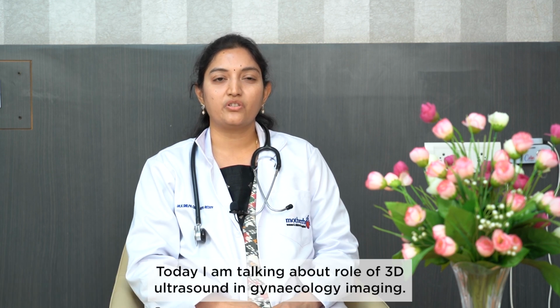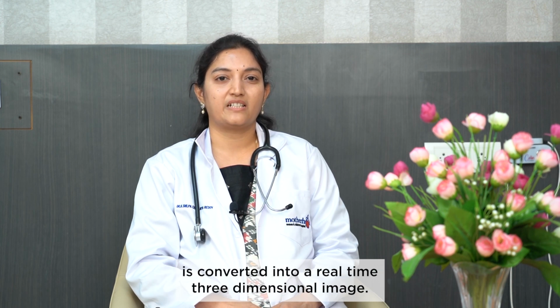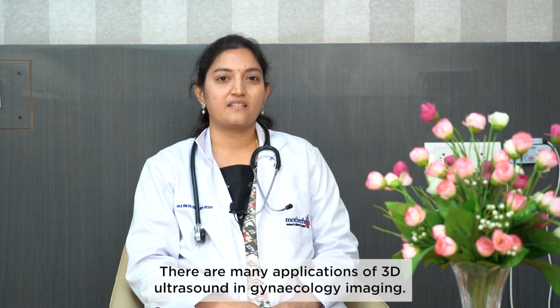Today I am talking about the role of 3D ultrasound in gynecology imaging. 3D ultrasound is a special technique where a two-dimensional image is converted into a real-time three-dimensional image. There are many applications of 3D ultrasound in gynecology imaging.